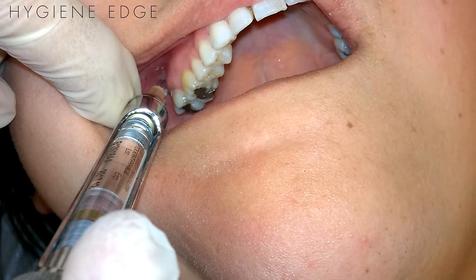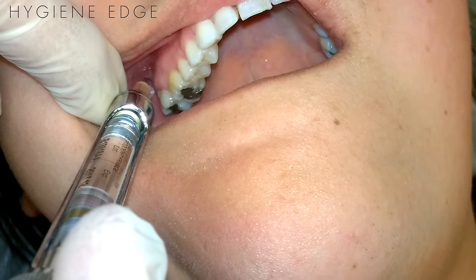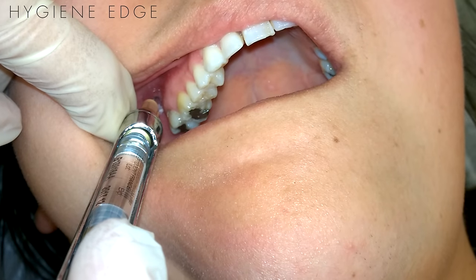Use a long needle — I have a 27 gauge long here. Insert at the same PSA location, which is distal to the second molar at the height of the mucobuccal fold. Insert about 30mm, or three-fourths of the needle length, at the same 45-45-45 angles as the PSA.